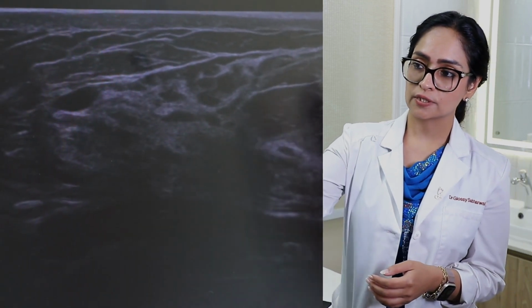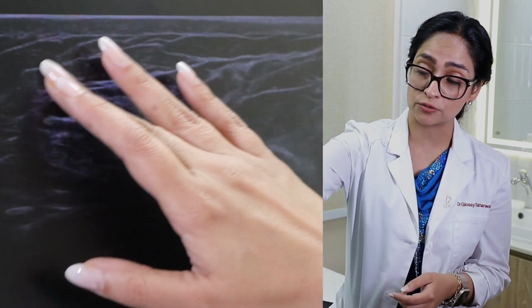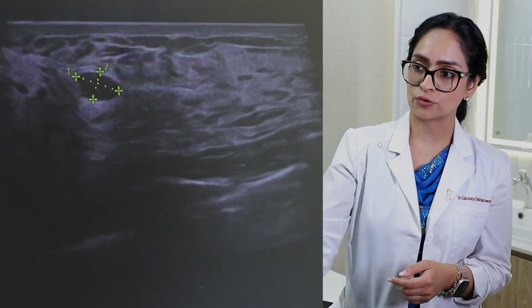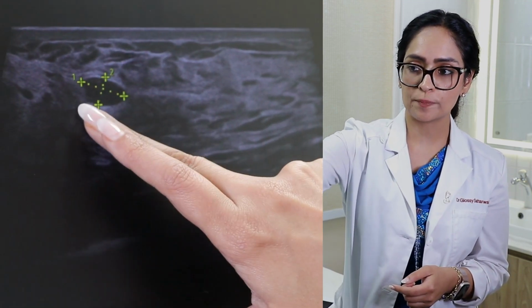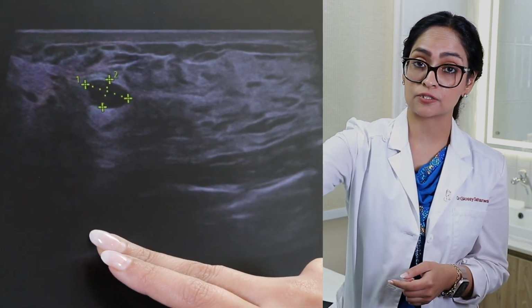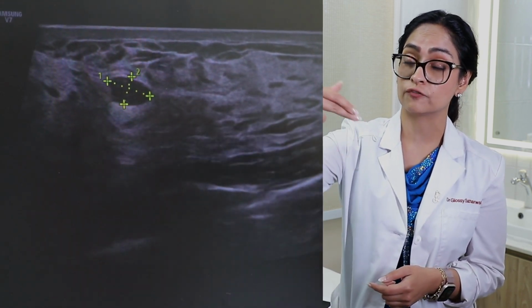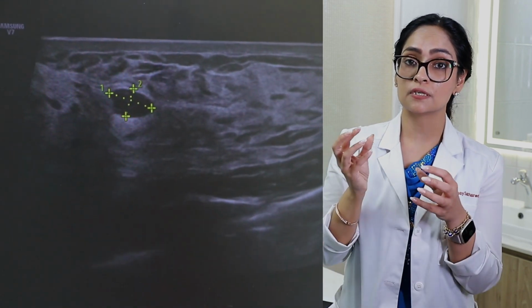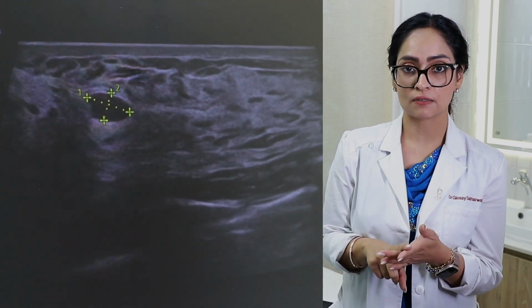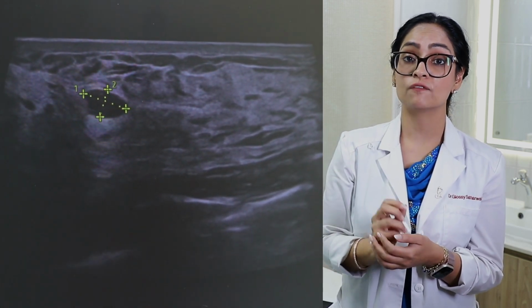If you look at this ultrasound, we see the normal premammary zone, we see the normal mammary zone, but what we do see is that there is a hypoechoic mass. Further screening of the breast showed another hypoechoic mass. Now there is no posterior shadowing if you look carefully. There is no posterior shadowing, that means that there is no calcification. There is no posterior acoustic enhancement, that means this is not a fluid containing mass. Then what is it? Which is a hypoechoic, oval, well defined with minimal peripheral vascularity, and the vascularity sometimes is not even picked up. Multiple places, these are small fibroadenomas.